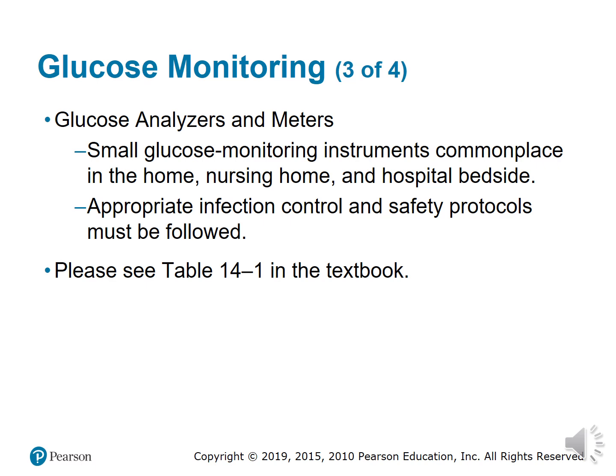Normally, if a patient is an infectious patient, they usually have an extra meter that they'll put in that patient's room, and that meter is strictly used for that patient only, for no other patient but them.